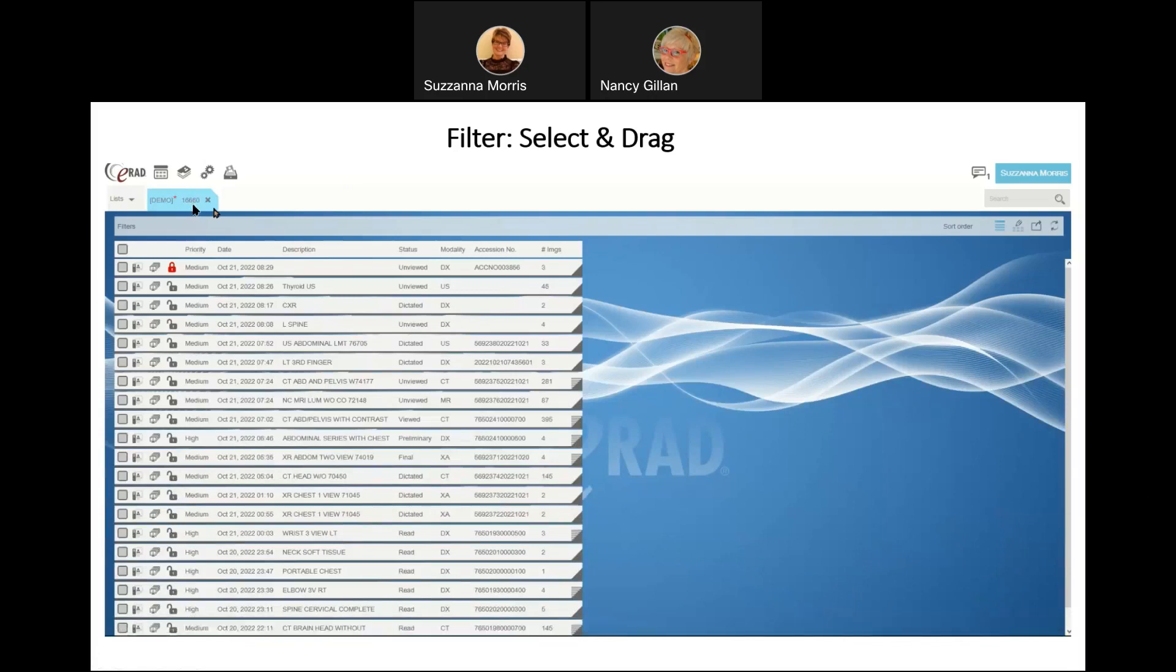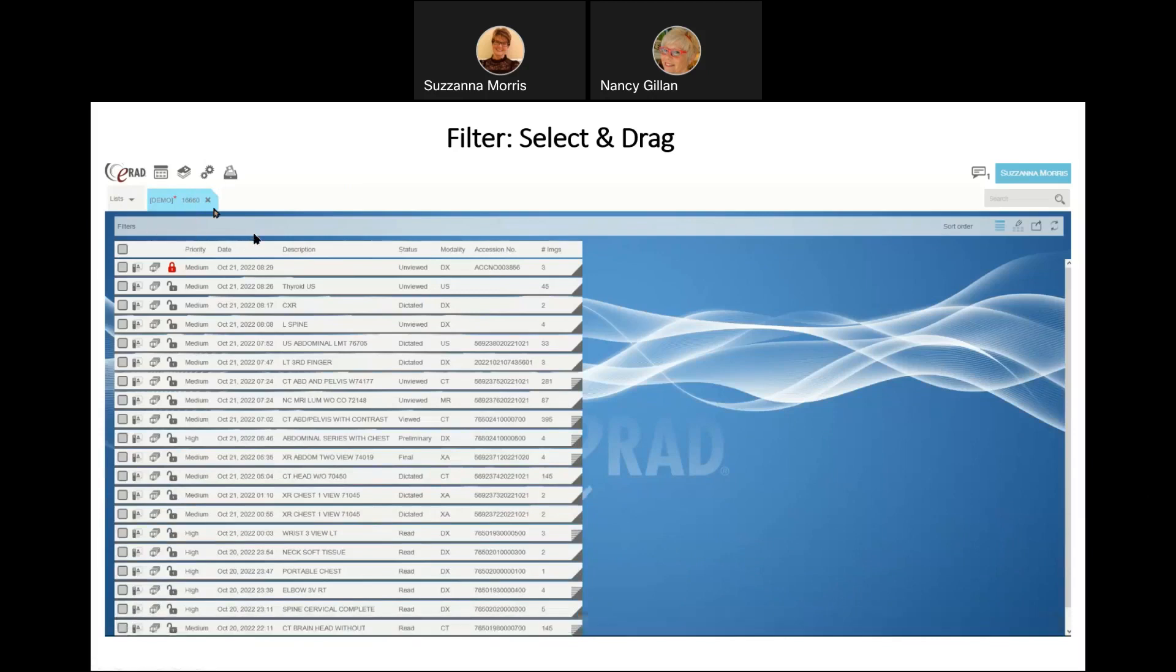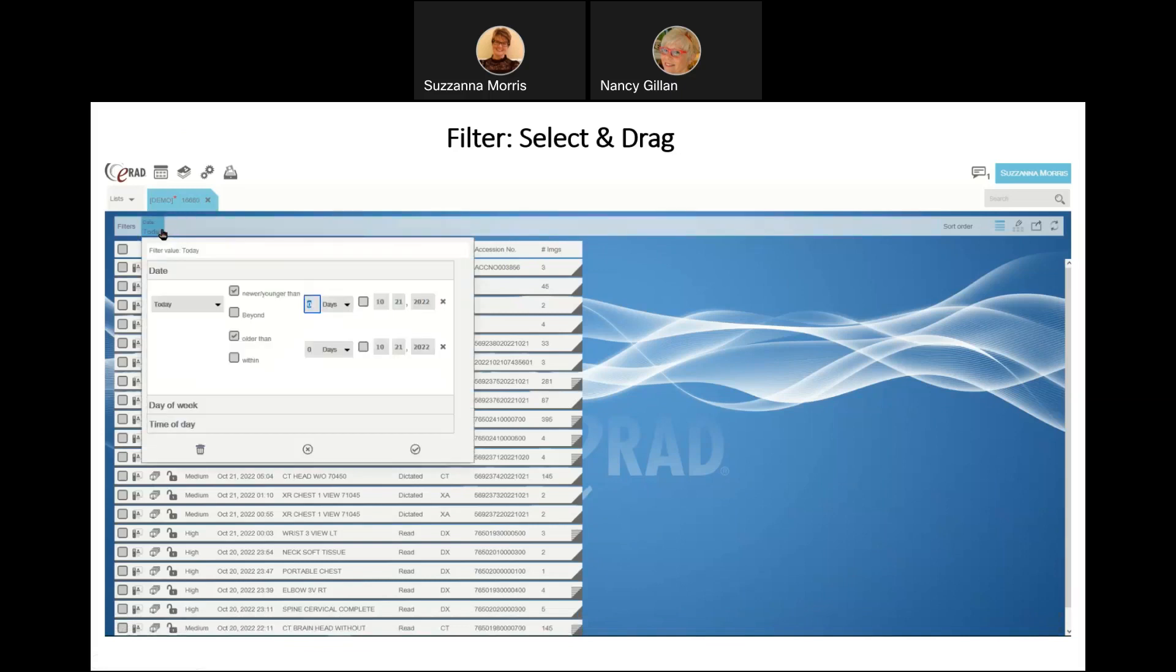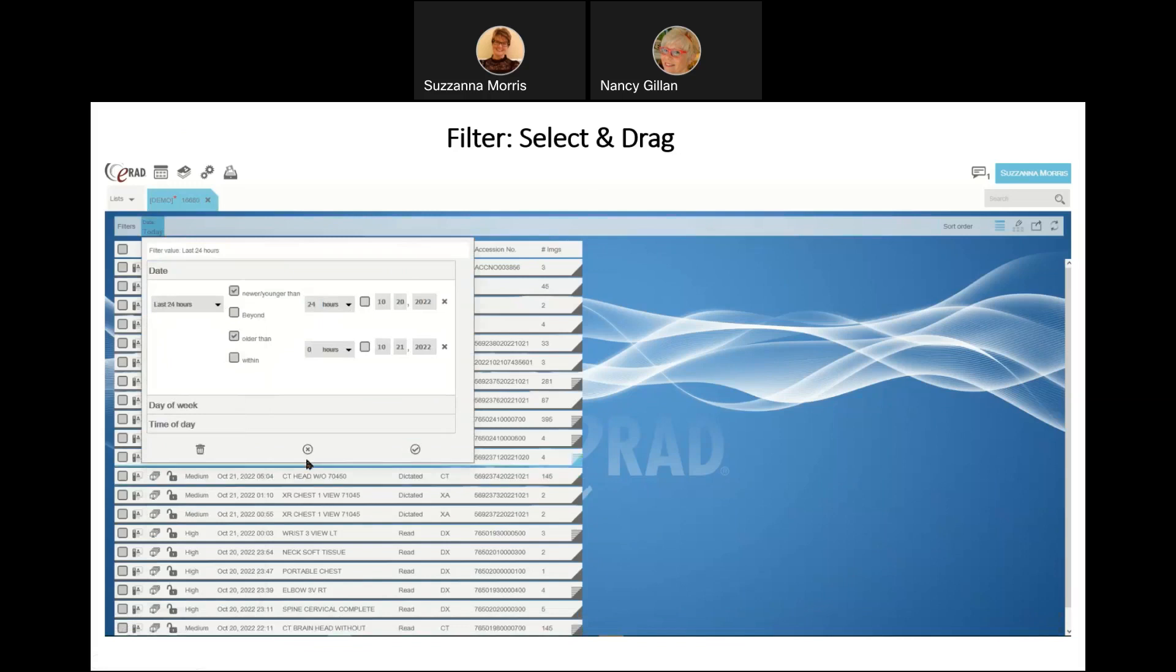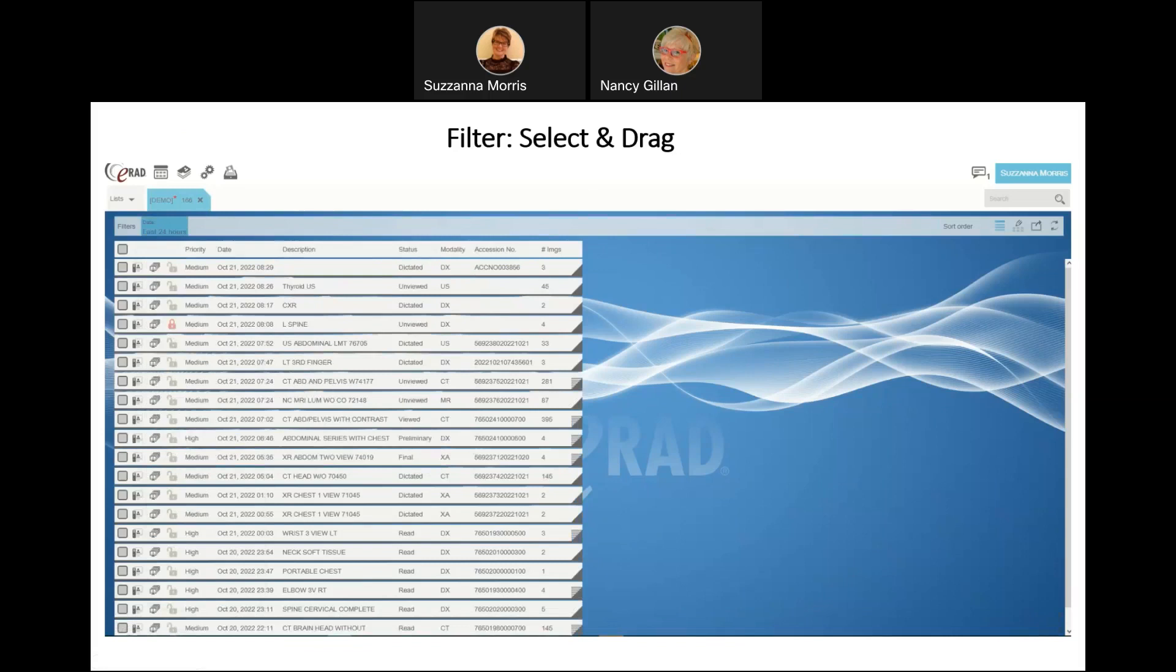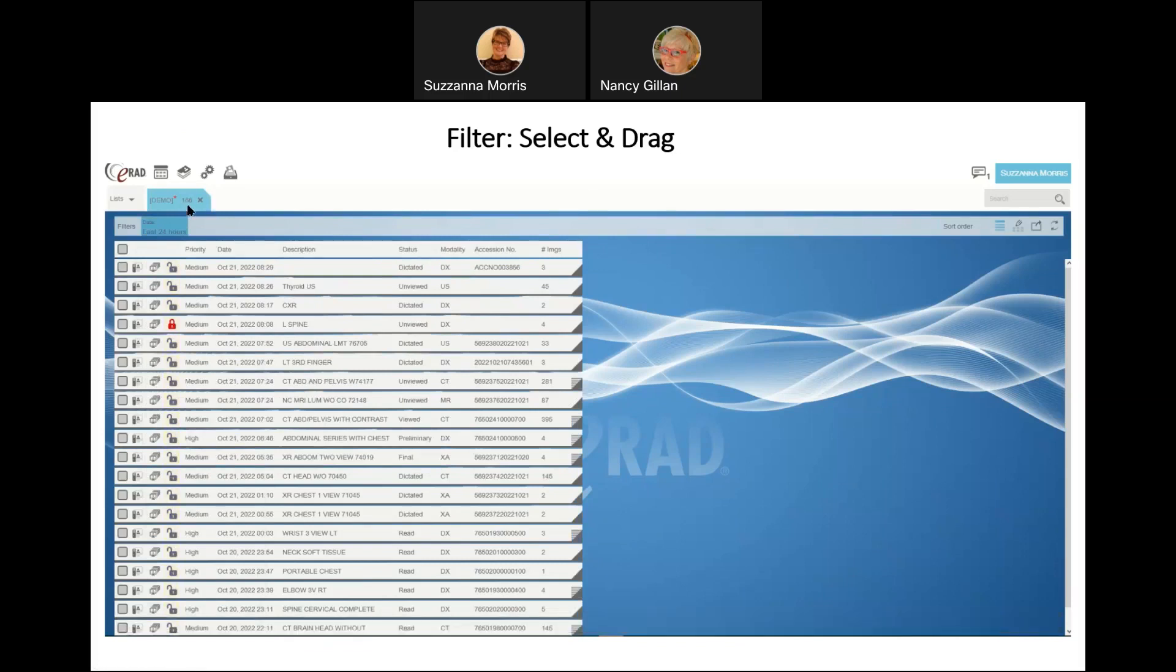Different filter tabs can be added to this bar for the user to customize your work list. The first way to start is by filtering, and there are multiple ways to do that. For this example, we're going to filter by selecting and dragging the value we would like to filter this list by. I'm simply selecting the column header date and pulling it up to the top, and I selected the last 24 hours. When I hit my green checkmark, it initiates the query, and you can see that I've returned 166 studies now, as opposed to just over 16,000.